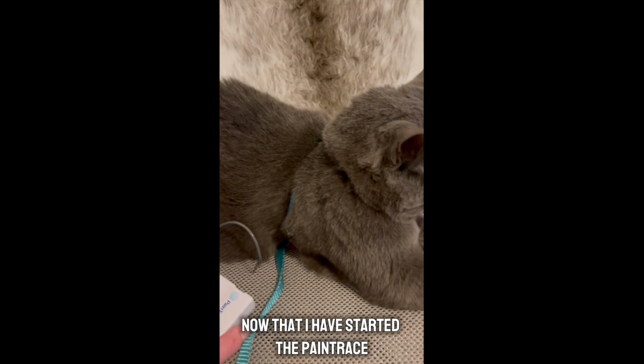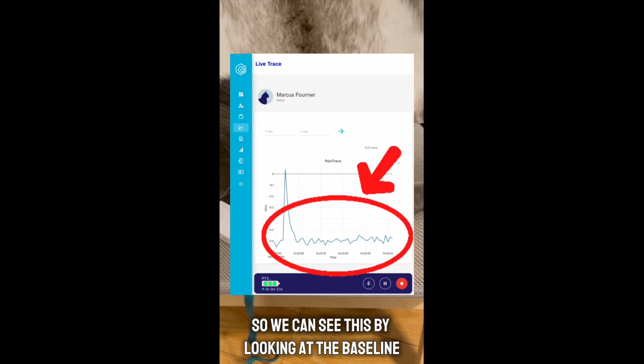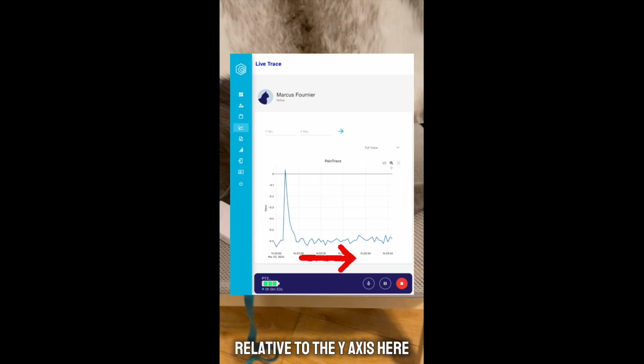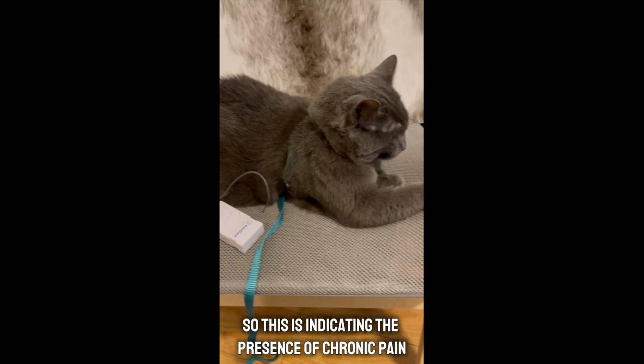Now that I have started the PainTrace, we can immediately see that there is some chronic pain. We can see this by looking at the baseline relative to the y-axis. Here we can see that relative to that y-axis, the baseline, which is in blue, is negative and it's hovering around negative 0.6. So this is indicating the presence of chronic pain.